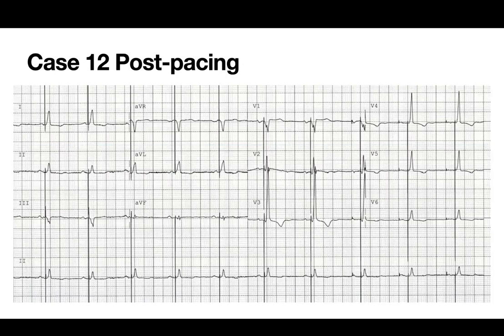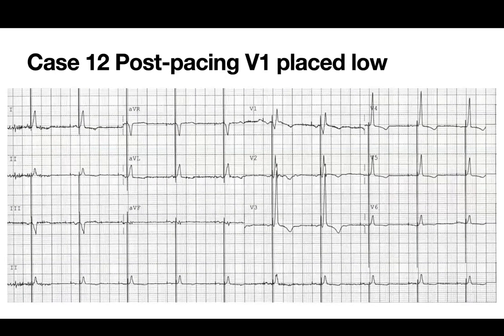Your LVAT is not that bad. You have a little isoelectric segment in V6. It's a tough call. I think it depends on what you see on imaging, how stable is the lead, what the threshold and impedance are. Go next. I've been burned a lot in V1, doing a couple more turns.